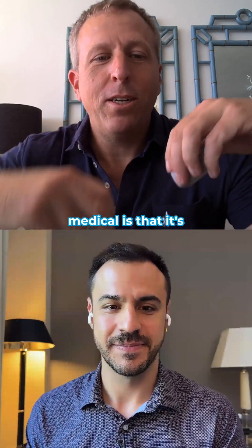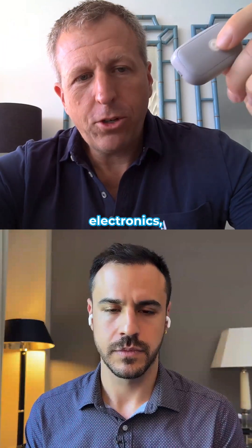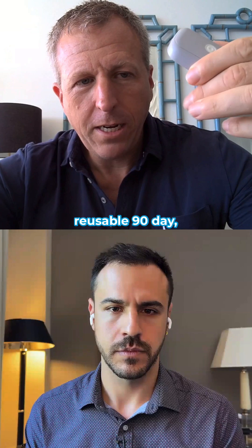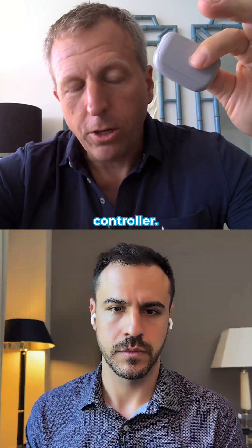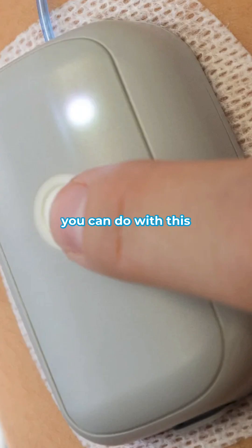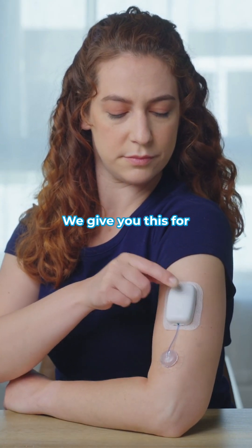The reason we called it Modular Medical is that it's a two-part pump. All the key electronics live in this reusable 90-day controller. This has the drivetrain, the Bluetooth chip, the NFC, and the system-on-chip. Everything you need to do with this product you can do with this button — priming, bolus delivery. This lasts for 90 days and we give you this for free.